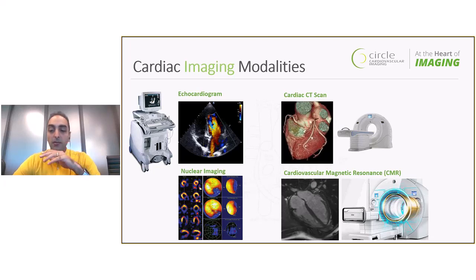And that is because MR imaging has considerable benefits. For example, MR imaging uses magnetic fields and radio frequency waves for imaging, therefore it is safe. And its physics allows imaging of different properties, such as tissue properties, and visualization of temporal dynamics, which can be used to look at how the structure of the heart is deforming. It can also be used to visualize flow, muscle fibers, and other things.